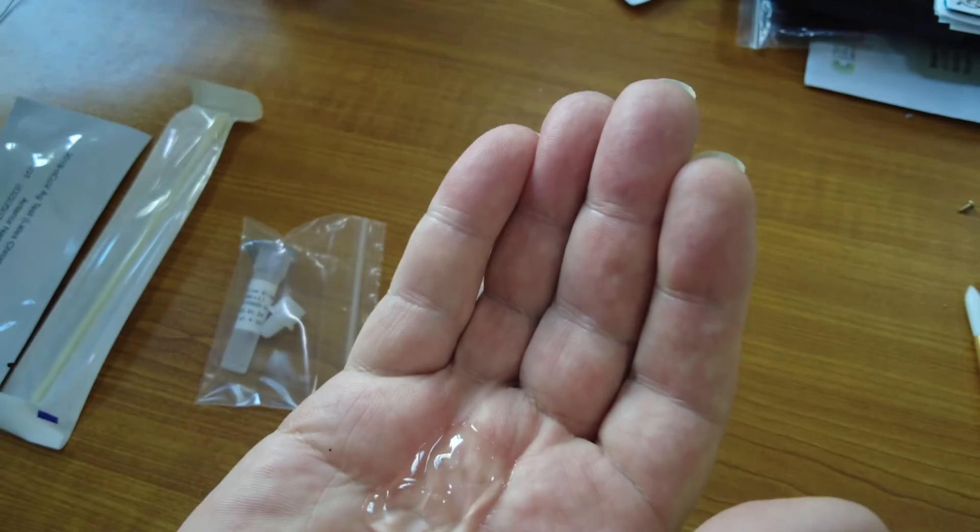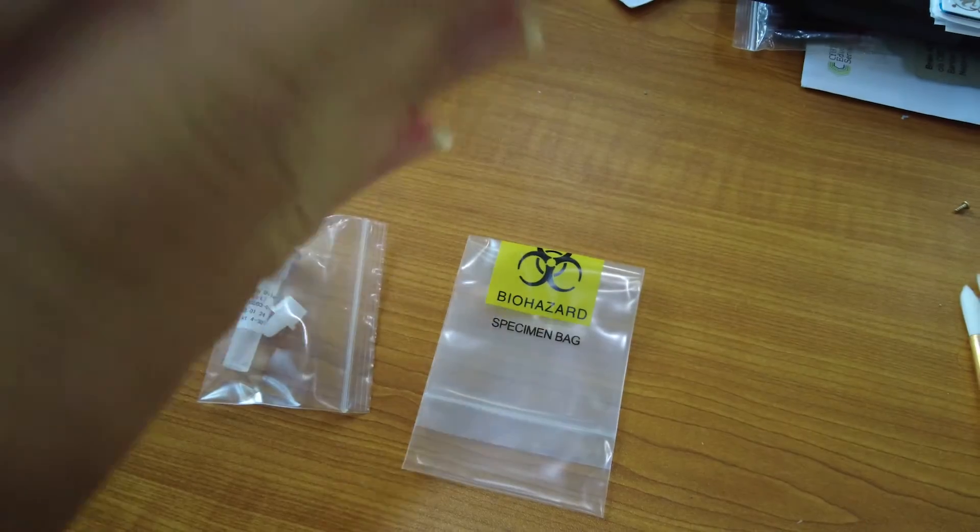Firstly, clean your hands with hand sanitizer. Next, we need to pull down our mask.